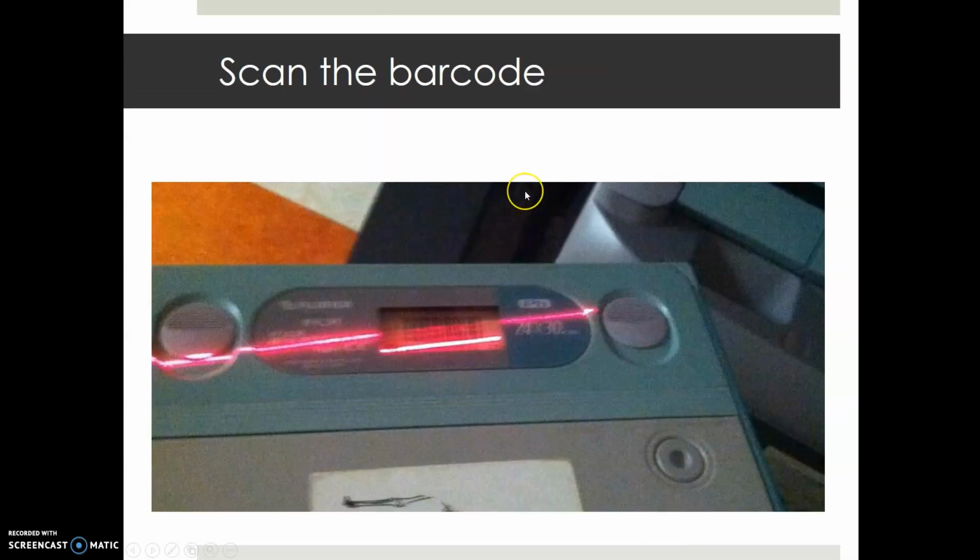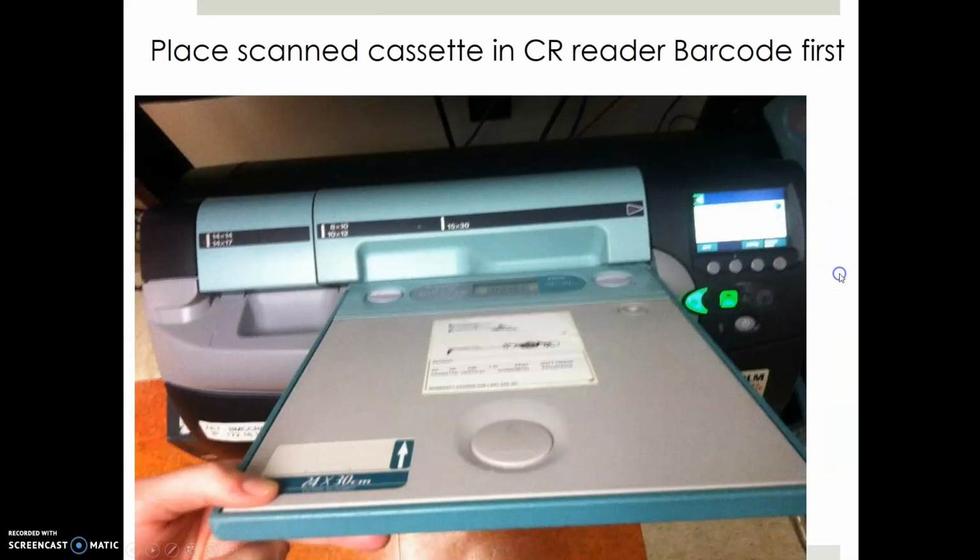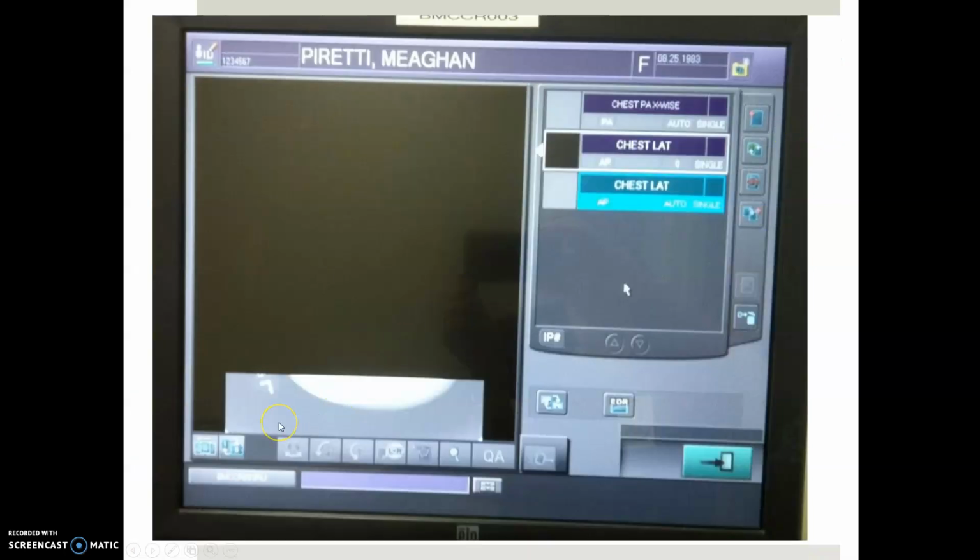All right, Benny, who will be in the student office for you. He needs an x-ray. So we took the x-ray. You need to scan the barcode at the hospital. Then you're going to put the cassette in barcode first and push it all the way to the right. And it will scan slowly up till you get an image.